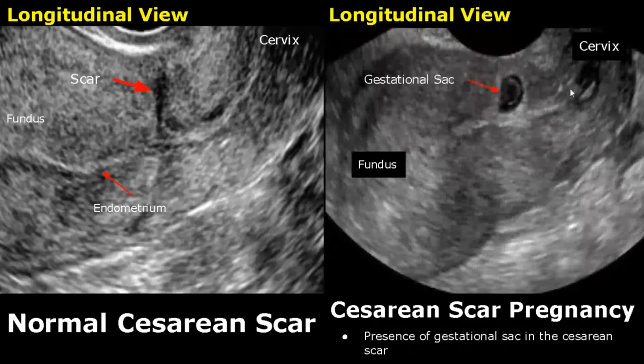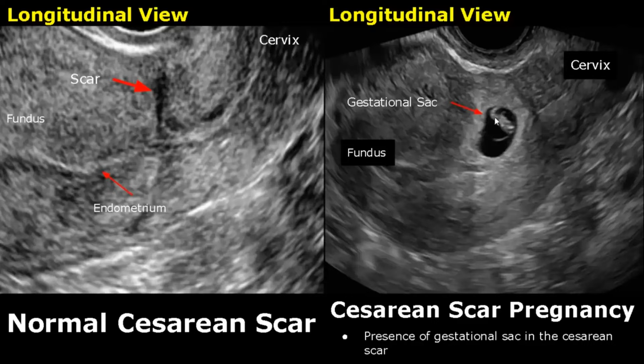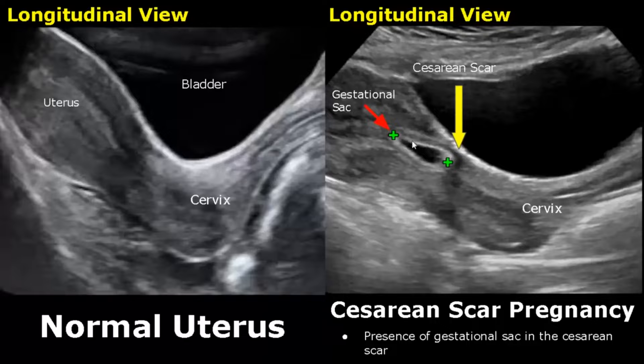Caesarean scar pregnancy is very rare — it is a type of ectopic pregnancy, but not entirely accurate since the gestational sac is still implanted within the uterus. The gestational sac is present in the caesarean scar. Here is another image of a caesarean scar pregnancy where we can see the embryo very clearly. This is a transabdominal image showing the gestational sac within the caesarean scar.